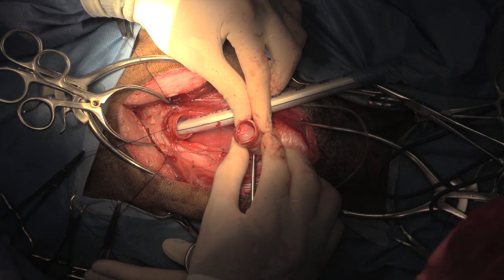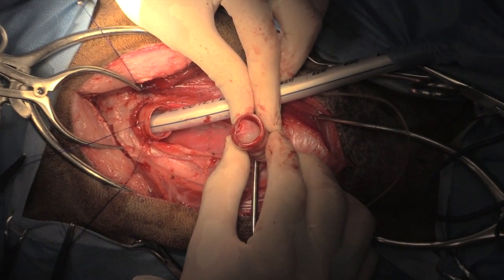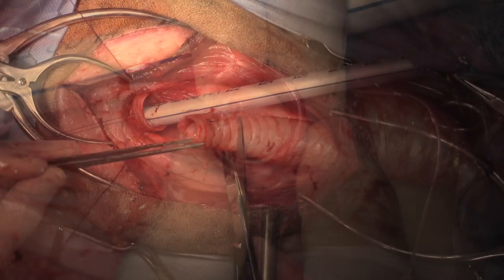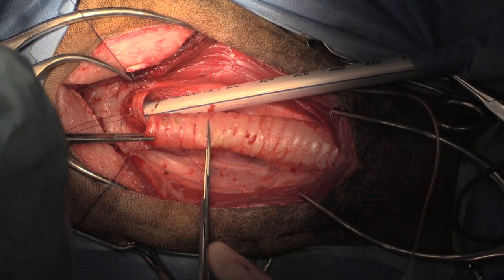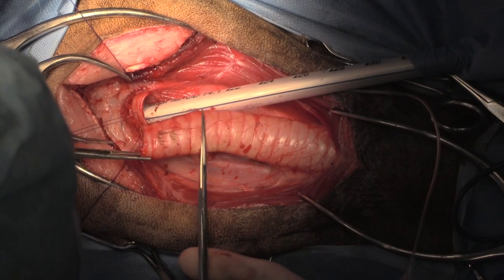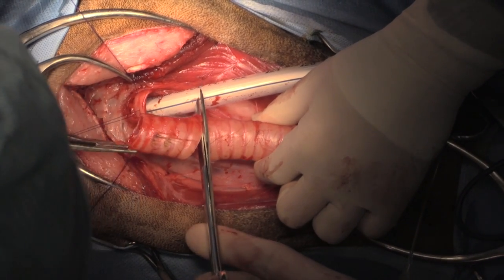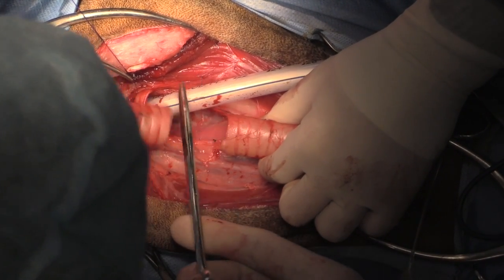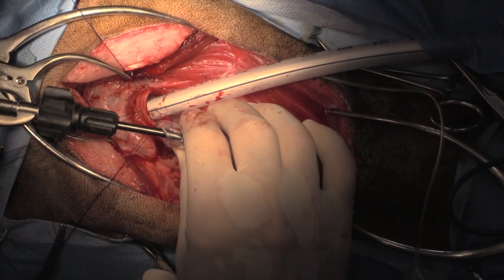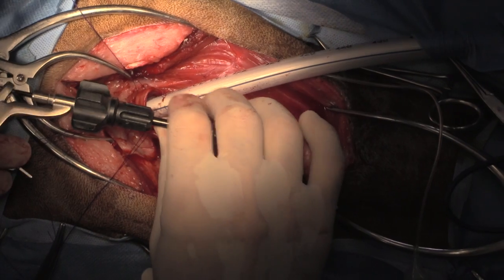We can now see, looking into the lumen of the trachea, the mass which was completely occluding the lumen. The proximal end of the trachea was then transected to allow removal of the mass. A laparoscopic grasping forceps was passed down through the old endotracheal tube and then out through the oral cavity.